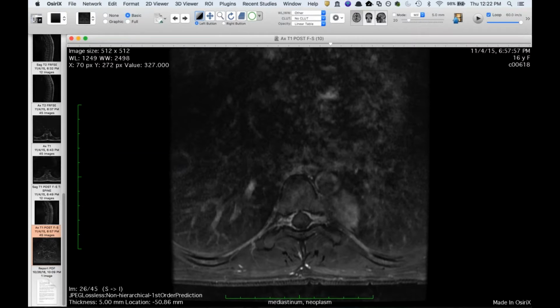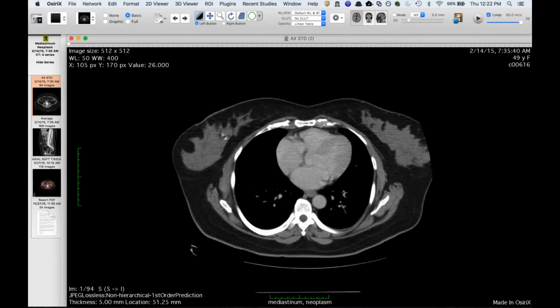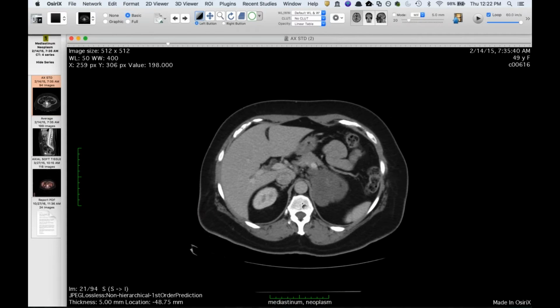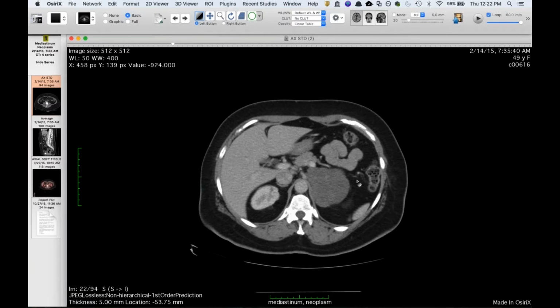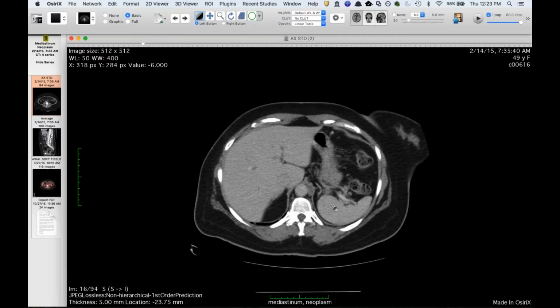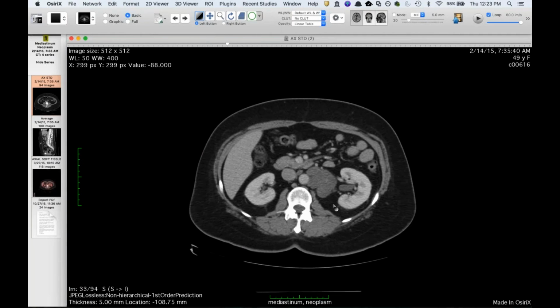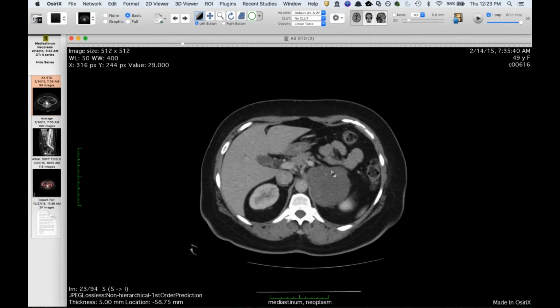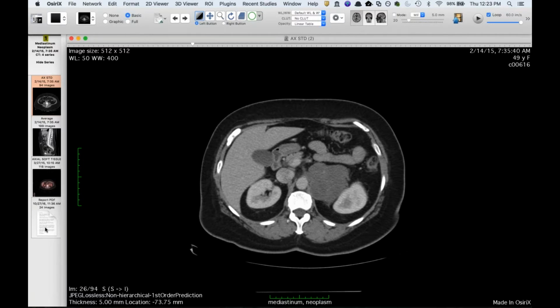And I showed that one to set up this next case. This is one I saw yesterday, and I show this because we often look at the abdomen. This was an outside study. This is a 49-year-old woman, and she has this mass involving her left adrenal gland. I think this is a little vessel above her adrenal gland, and it's very similar in attenuation to that one. It's elongated, and this also turned out to be a ganglioneuroma when they took it out.